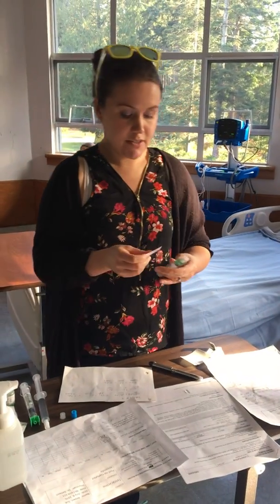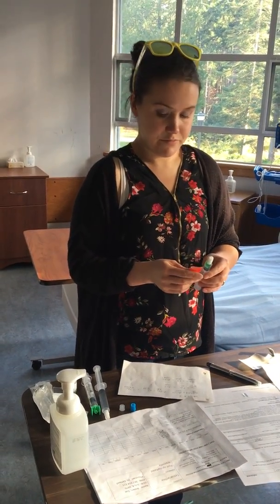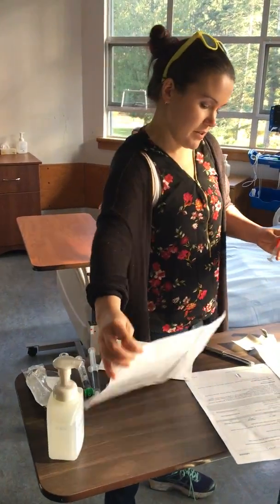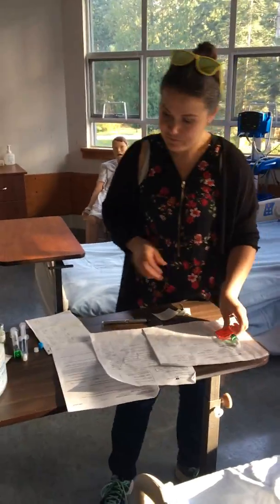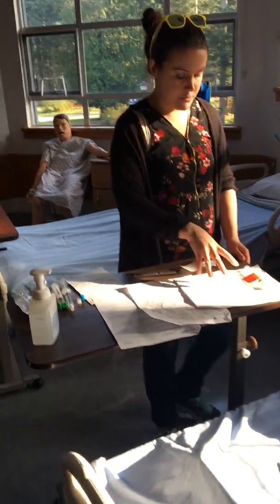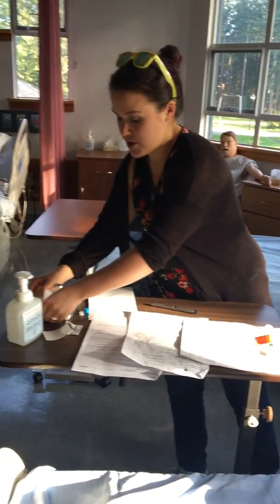My 7 rights, and now I have what I need. So I'm going to take my MAR in with me to the patient's room. So we'll pretend I don't have all this stuff. I just go in with my MAR, my medication, and a bunch of alcohol wipes.